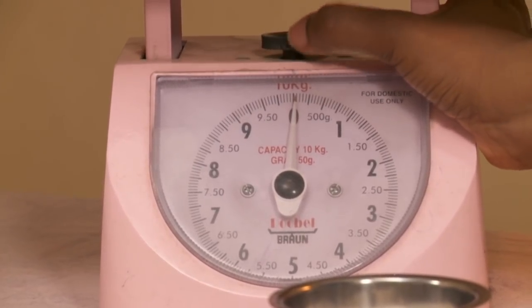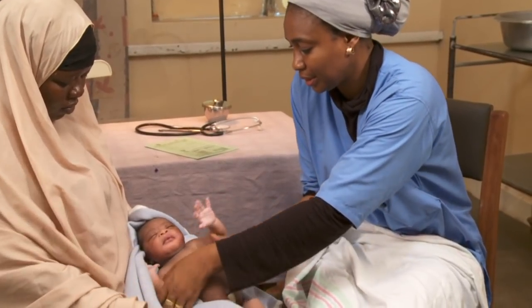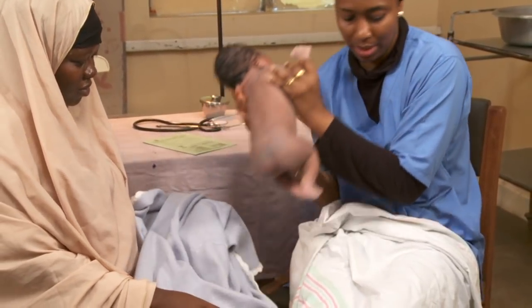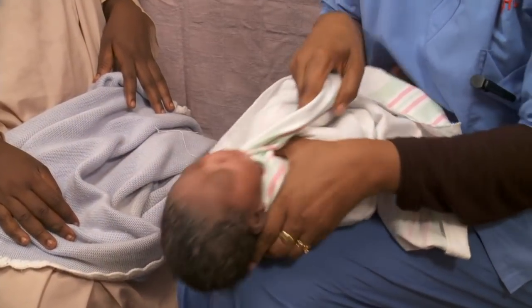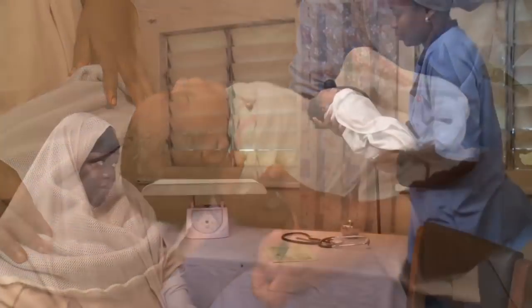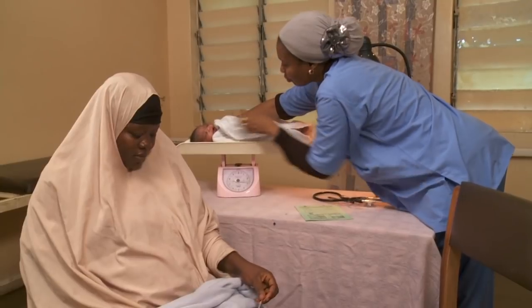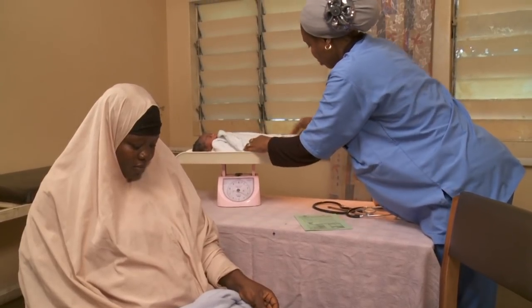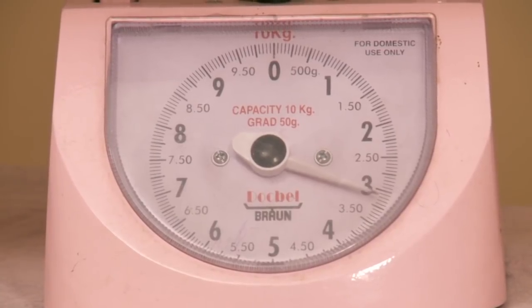Completely undress the baby and wrap him snugly in the cloth to keep him warm and to reduce his movements. Place him on the scale, but record the balance only when the baby and the pan are not moving. Record the weight.